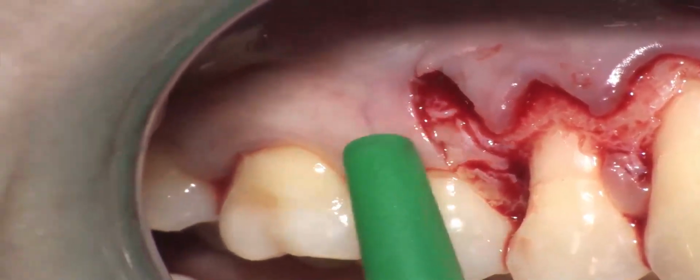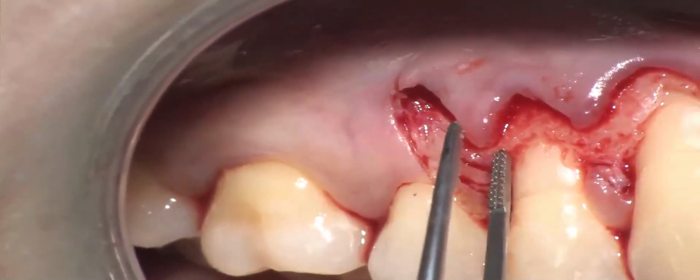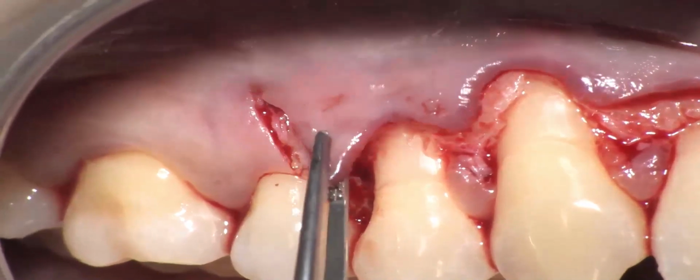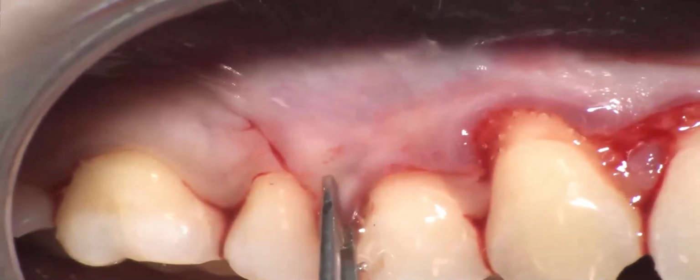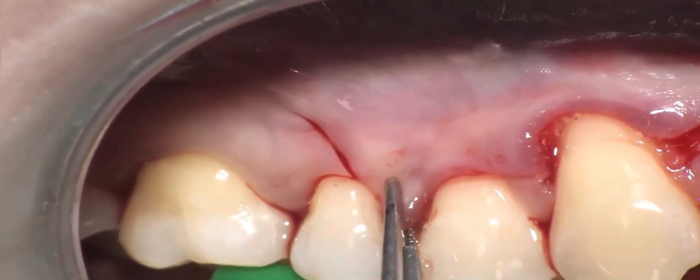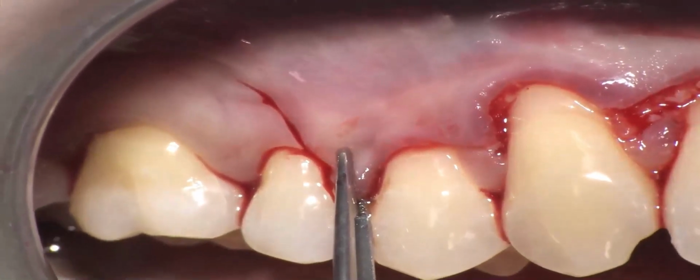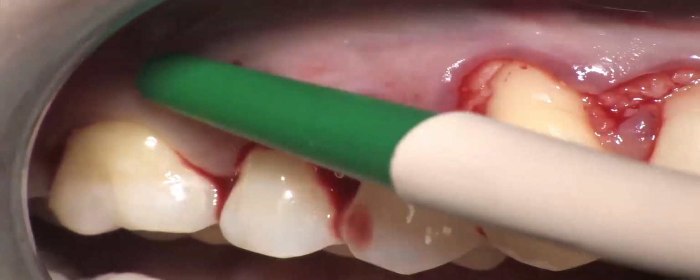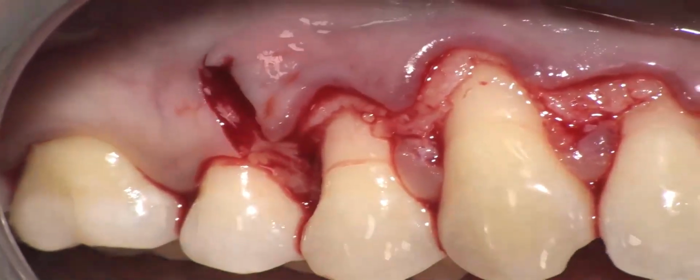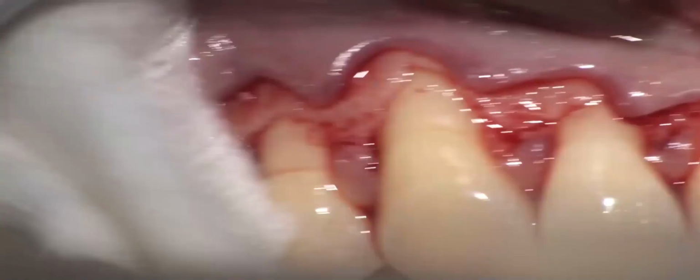So now when I'm going to place my surgical papilla above the anatomic papilla, there is no area that will heal by secondary intention, but everything will be perfectly covered by my flap. Now we do the same thing on the other papilla.